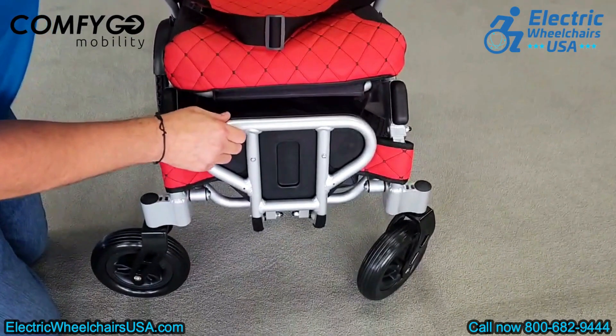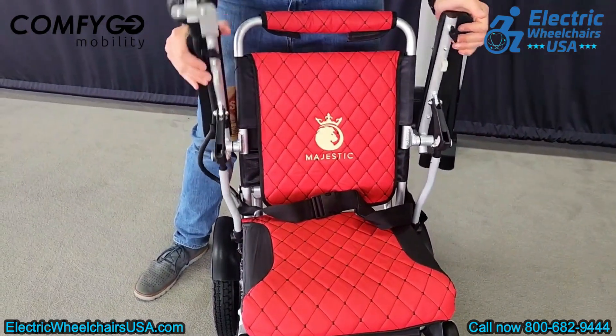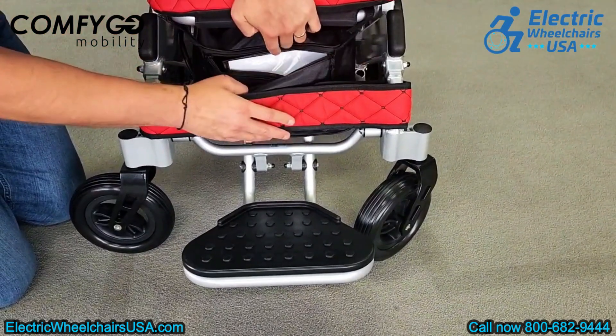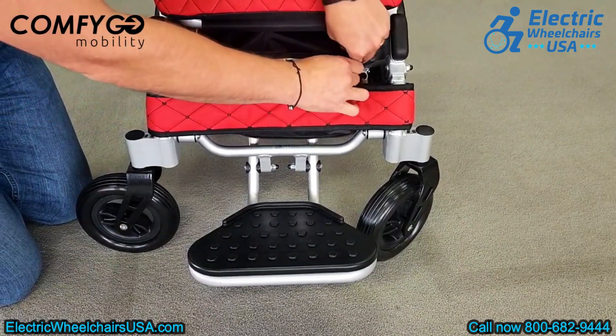The chair features a flip-up footrest and armrests, making it much easier to get in and out of. Underneath the seat, there's a zippered storage pocket where you can store your belongings. We suggest keeping the charger there for easy access.